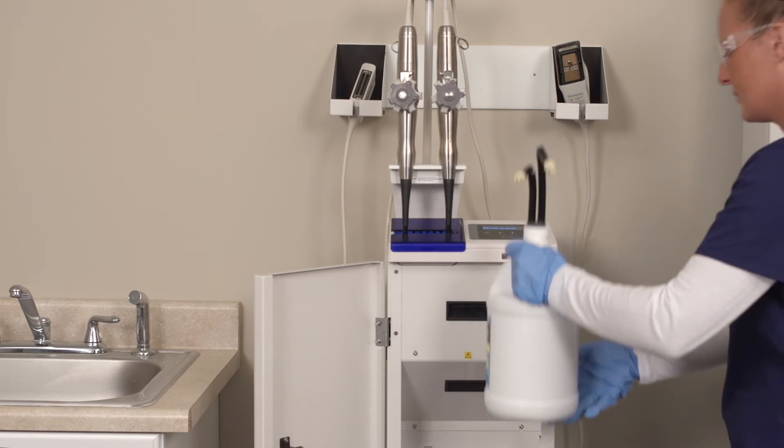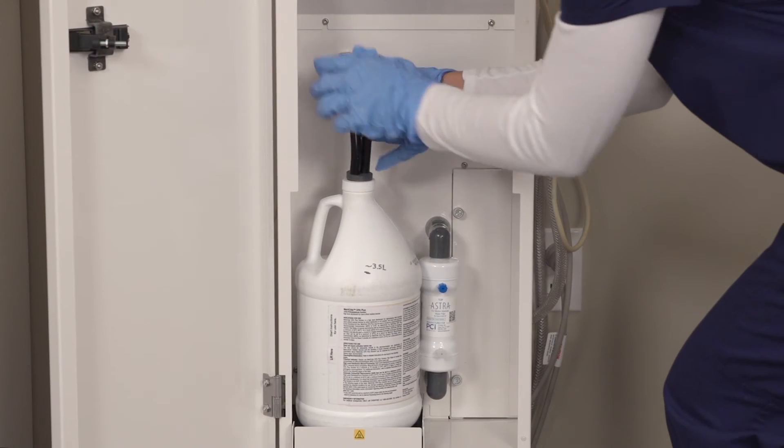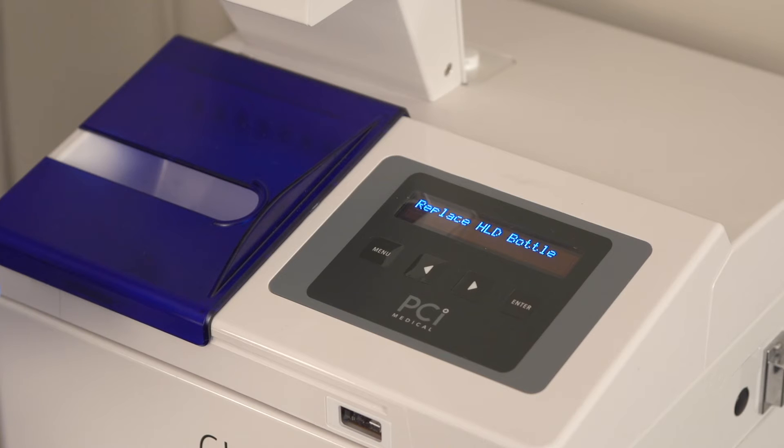Special connectors make the disinfectant bottle easy to install. Scan the bottle, install, and close the door — you don't have to open the door again for up to two weeks. Everything's contained. There's no messy pouring, splashes, or spills. The Astra even tells you when to change the bottle.